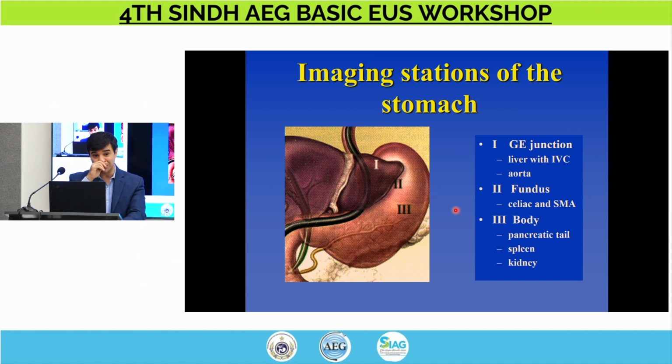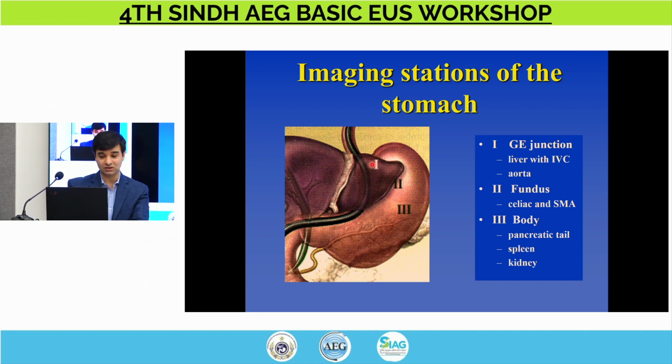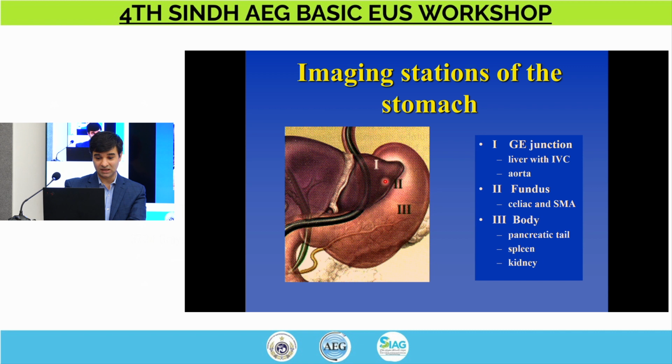Okay, so we'll go over the gastric stations. Just to reiterate, think about these as not something that you need to document on your reports. This is not essential. These stations were defined early in our course of EUS to give you an understanding of the periluminal structures and what you should and should not look for at a particular area. The first part is where your transducer is located, about a centimeter or two beyond the EG junction. The second upper GI station is where you're about 4 or 5 centimeters further down, and the third is where you're almost touching the greater curvature of the stomach.